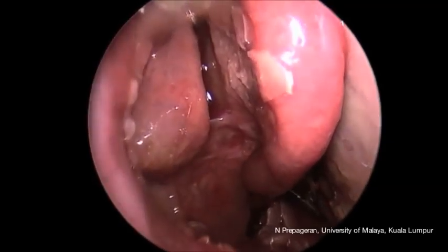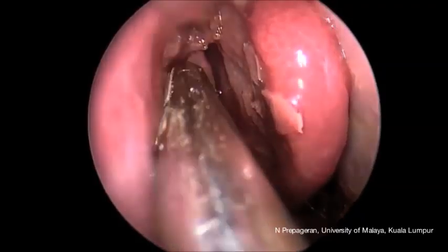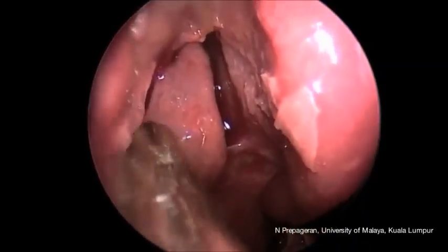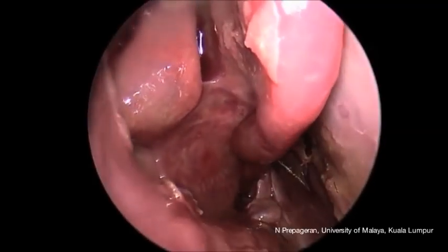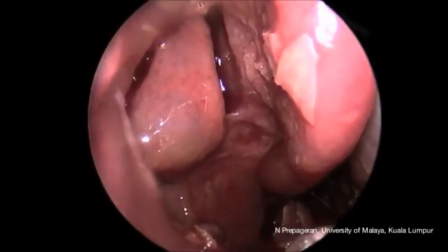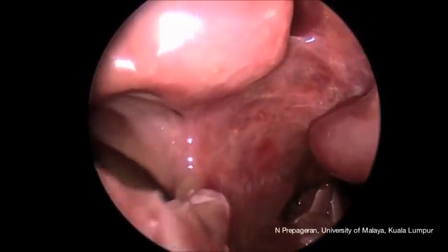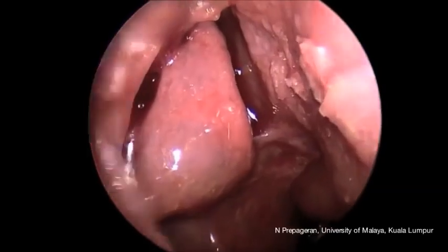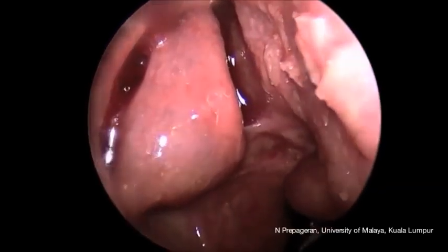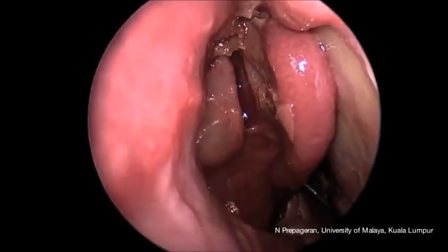Let's do a total ethmoidectomy now. We've already removed the uncinate process, and we can visualize the bulla. The bulla, as you can see, is very clear once the uncinate process has been removed, which is gate number 2, uncinate being gate number 1, and where the middle turbinate moves and laterally attaches itself is the ground lamella. So that would be the boundary between the anterior and the posterior ethmoids.